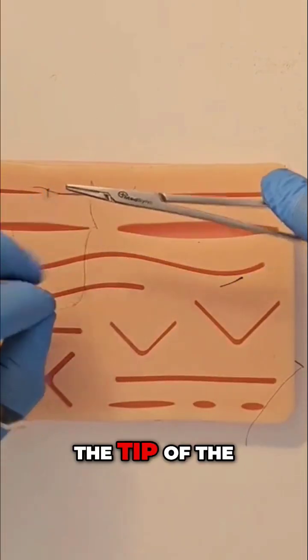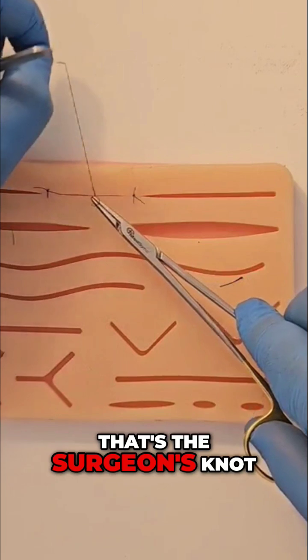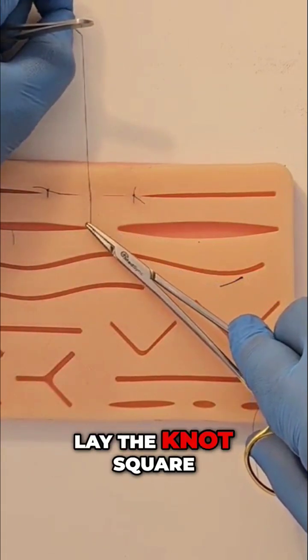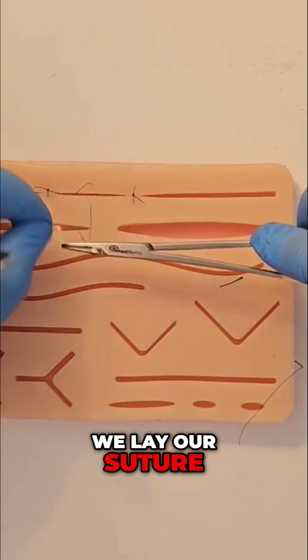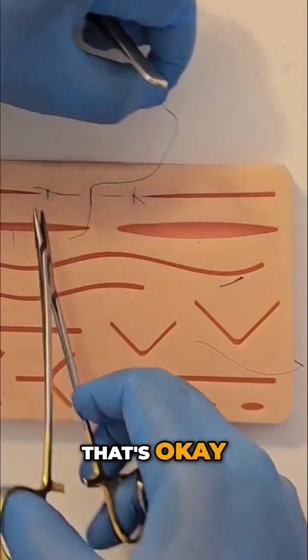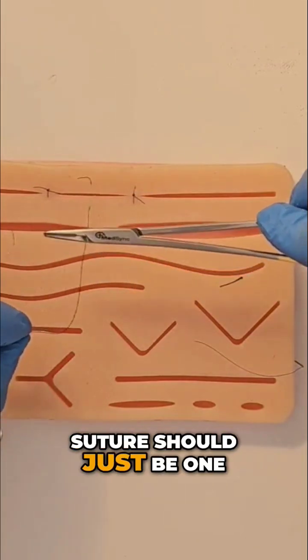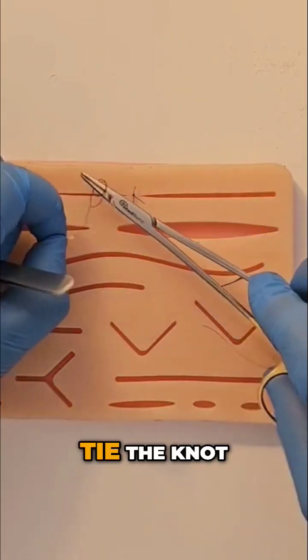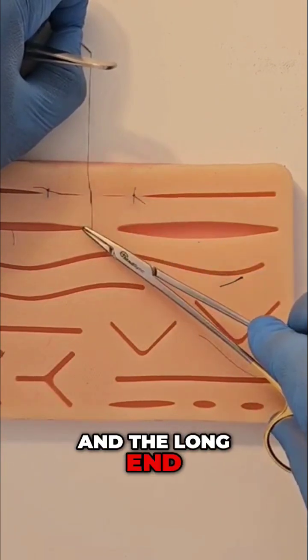Wrap it just around the tip of the needle holder — it's a small movement, two revolutions. That's the surgeon's knot. Lay the knot square; sometimes we lay our suture knot to the side, that's okay, but it's useful in certain circumstances. For your basic interrupted suture, just one, two — tie the knot and lay it so the short end and the long end alternate.